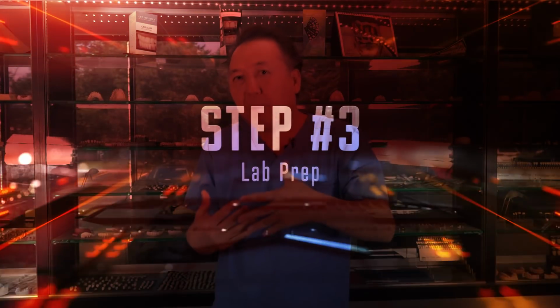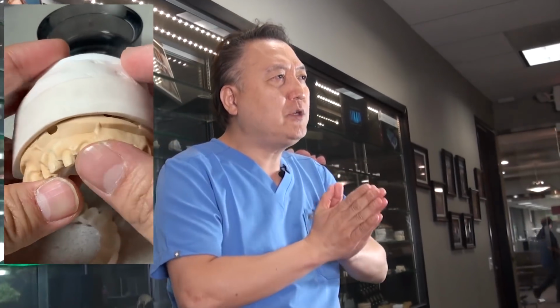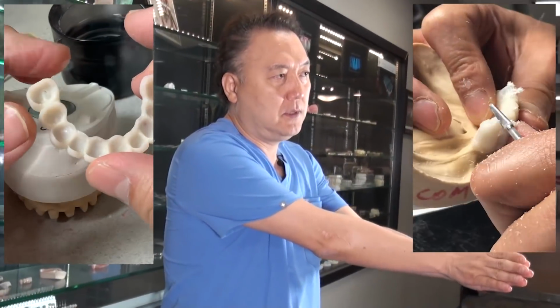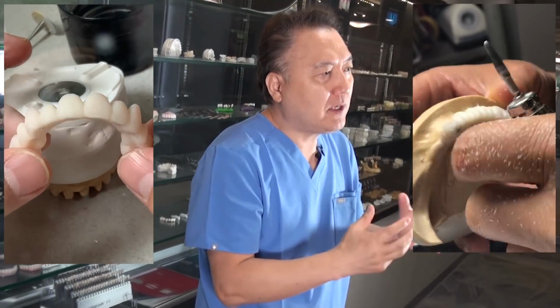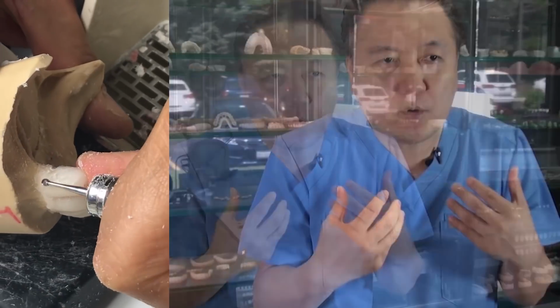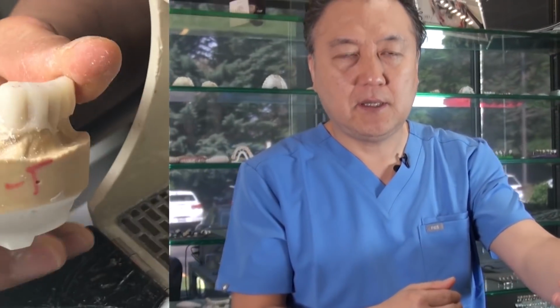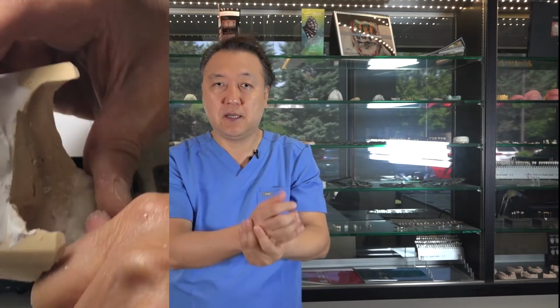Number three, the laboratory has to prep it. That is why the reduction is extremely important between doctors and me. Some doctors prep more, some prep less, depending on the patient. But here's my goal: I do not want to grind more than the doctor. If I grind too much, the patient may need a root canal, and I don't want that. So I'm trying to save as much enamel as possible, so the doctor can trim it and then make the temporization or reline it.